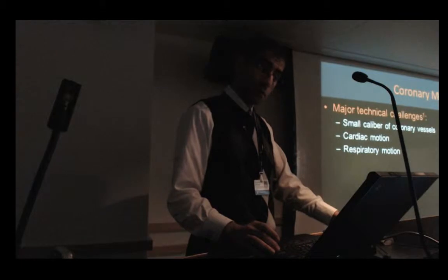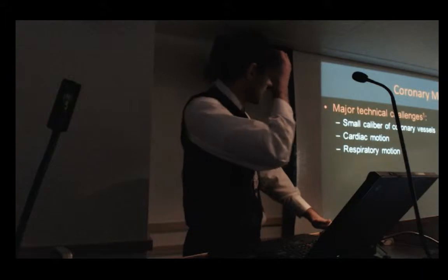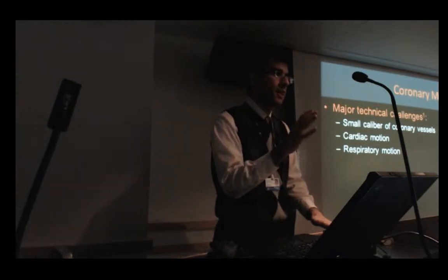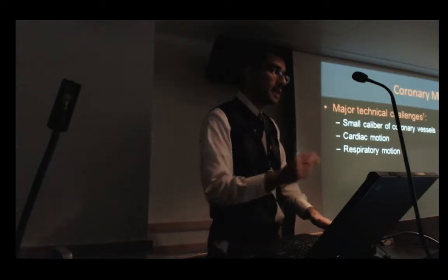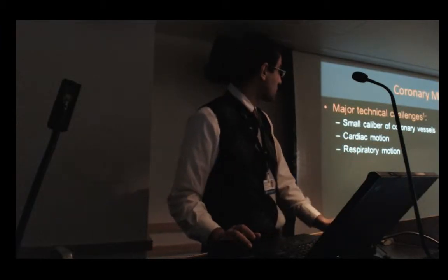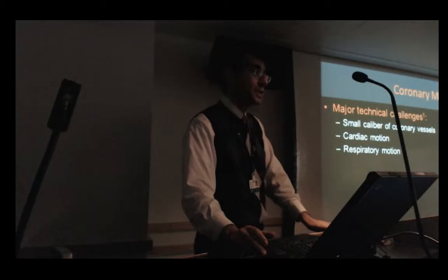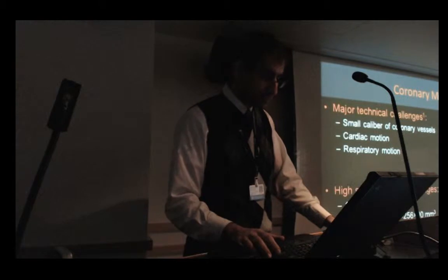In this talk, I'll talk about those clinical challenges, and I'll try to come up with some solutions to address them. The first challenge is the small diameter of the coronary vessels. The coronary vessels that we are looking at are around 5 millimeters. So having a high resolution image is necessary to detect significant coronary artery disease, meaning over 50% occlusion. We are also dealing with intrinsic cardiac motion and respiratory motion that we have to suppress during imaging to have very sharp images and therefore accurately detect coronary artery disease.